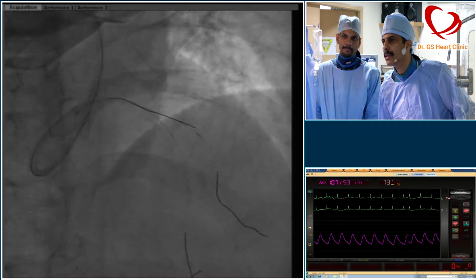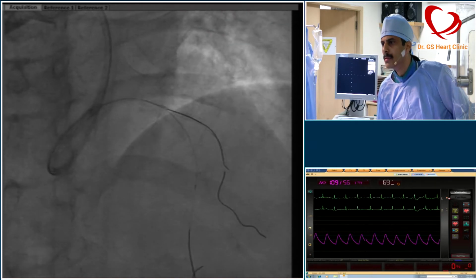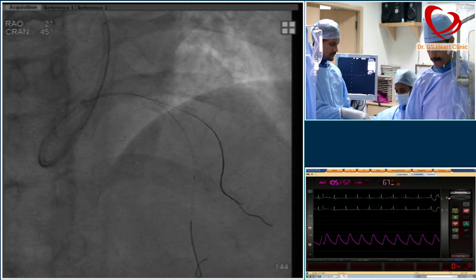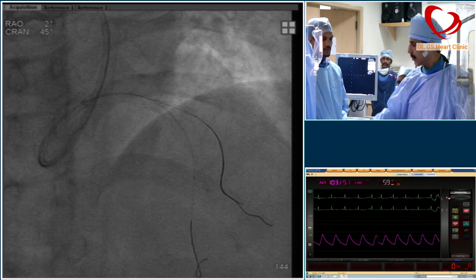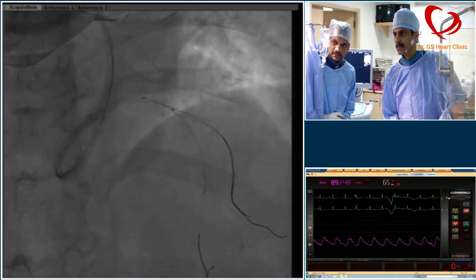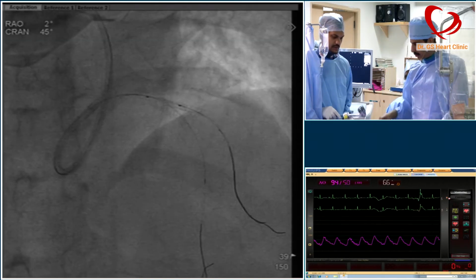Looks like this has gone down from that artery. Okay, let's try. Give me the balloon. Can you give me the balloon, Andrew? Give me a 1.5 balloon, if this is the smallest balloon you have. Yeah, it's crossed. Okay, good. So let us get that. Now this is balloon. Can you store this? Yeah, we have crossed the balloon.